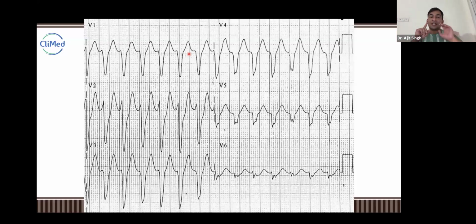So negative concordance means the direction of impulses or voltages in the lower chambers is completely negative. Understand? So that's why the QRS complex is inverted. Did you understand negative and positive concordance or not? Tell me, guys. Or did you understand in the ECG or not? Tell me.